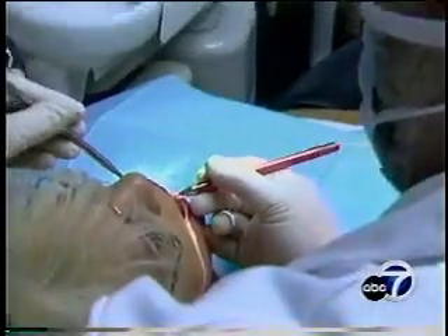Arlene couldn't be happier with her results. The healing was much faster. There was no soreness in her gums whatsoever.